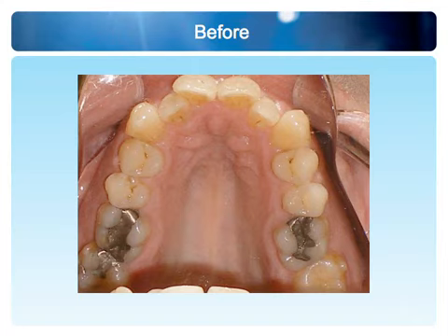And so, we know now the foundation is already laid in the right place, and we have to move the teeth to follow it. There is a lot of bone out here to move those teeth, to set them where they belong. So now we know we are starting out very narrow, improper arch width. Absolutely, improper arch form. Absolutely. We have a classic omega shape here.